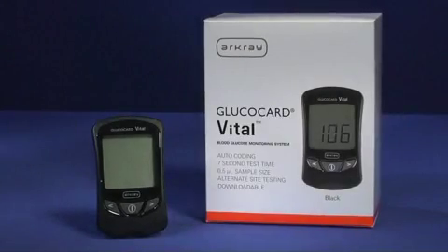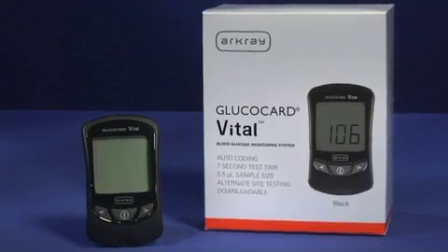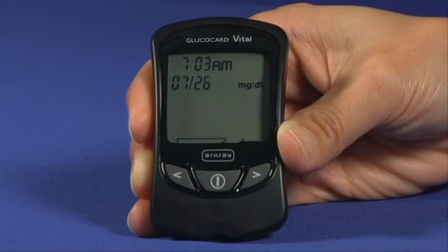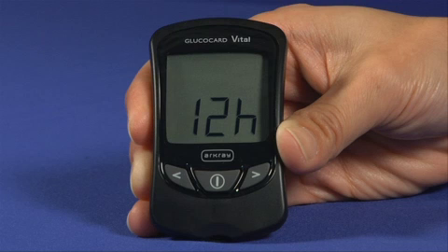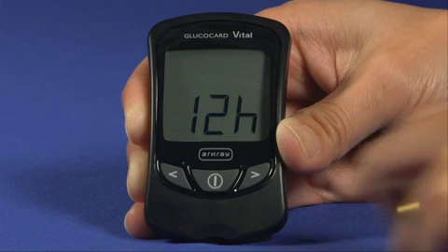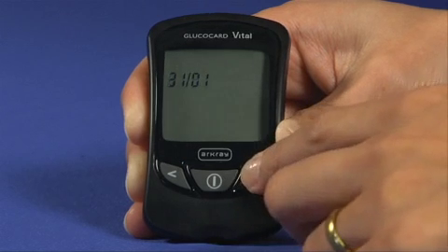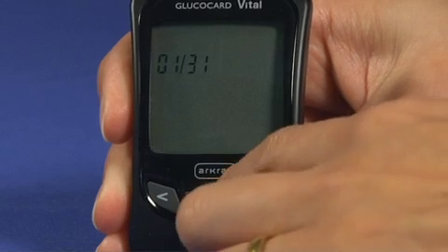Before using the Glucocard Vital System for the first time, you should set the time and date to ensure that results are appropriately marked in memory. To enter setup mode, press the on-off button to turn the meter on. When the insert test strip symbol appears, press and hold the on-off button for longer than 2 seconds to enter setup mode. Select either the 12 or 24 hour time format using the back or forward button, then press on-off to confirm. The date format then appears — select either month-day or day-month format and press on-off to confirm.